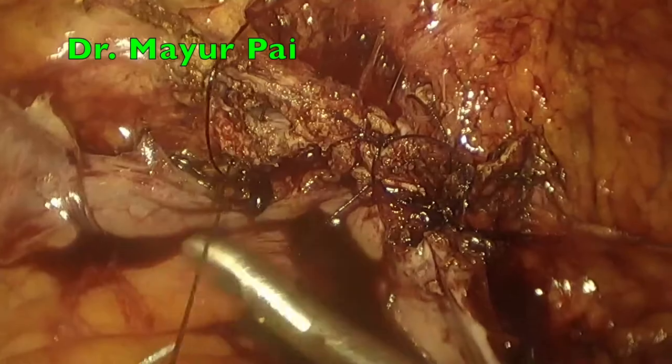In this particular case, we have closed the vaginal vault using 3 interrupted figure of 8 sutures.